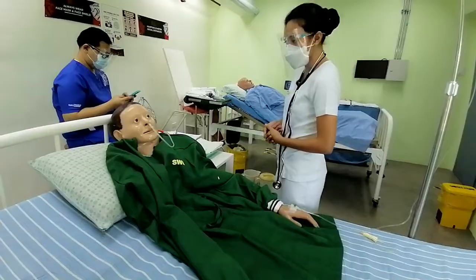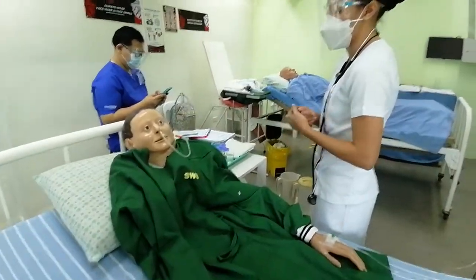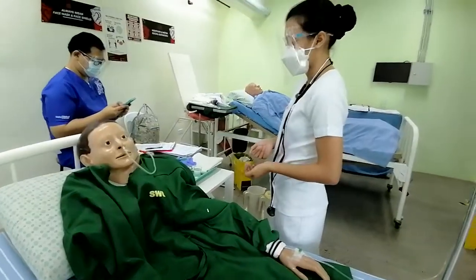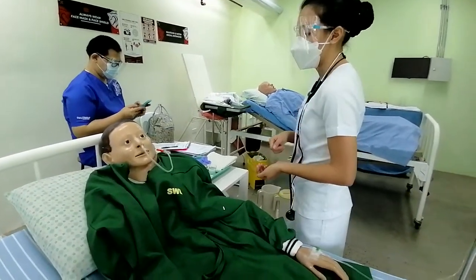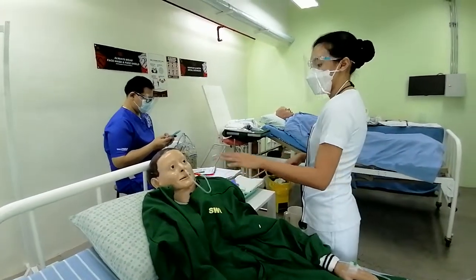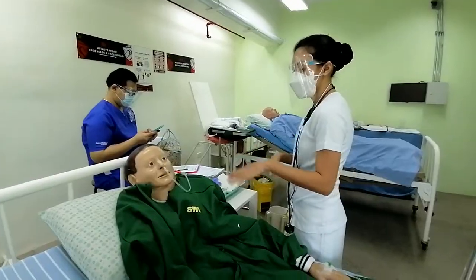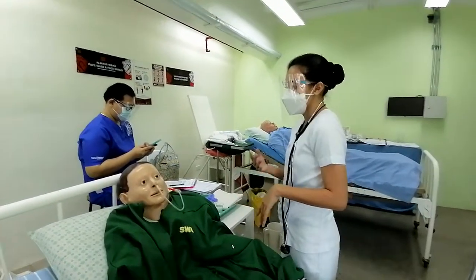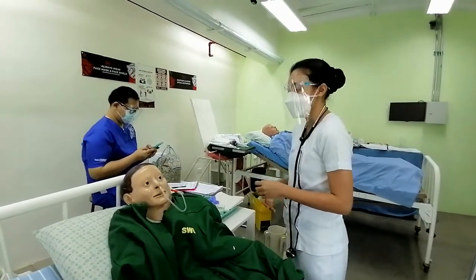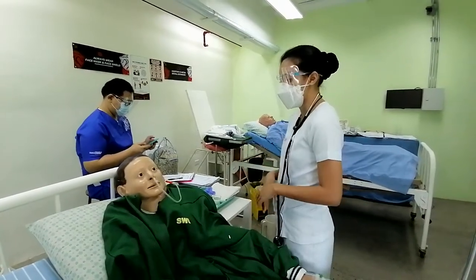And then after which, I will explain the procedure to the patient. So, sir, I will be providing you blenderized food, and the route will not be through your mouth, rather it will be through the tube that is being inserted in your nose, and it has the same process as when you are eating with your mouth. All of the contents will be placed in the stomach.